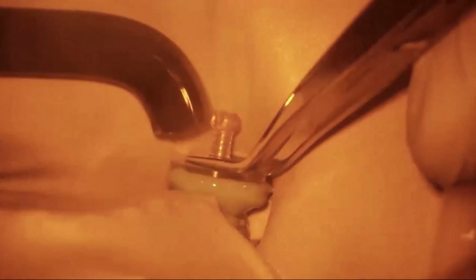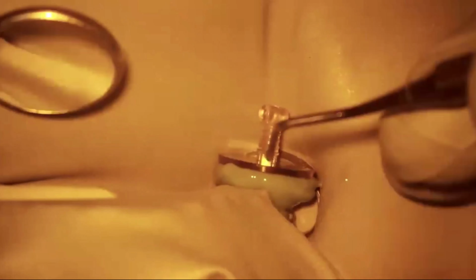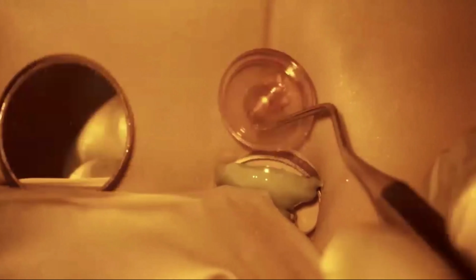And I cure it multiple times. Okay, so I'll cure one side, the other side. This is a sped up video. Now, at this point, I'm ready to go, but I'll hit it again with the light. If I feel like there's a little bit of a cantilever effect where it's tilting on one side or another, I may add some Sound Seal, just to get rid of some of those undercuts, give it a little bit more stability.